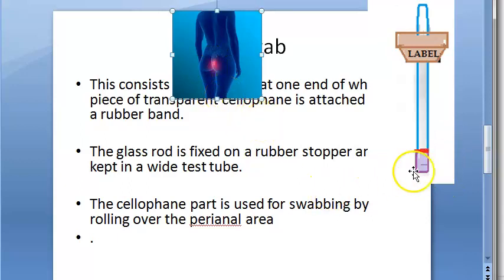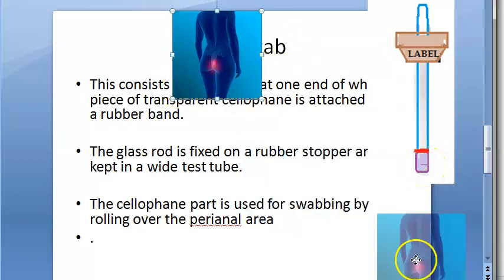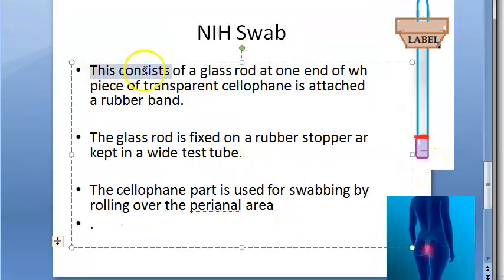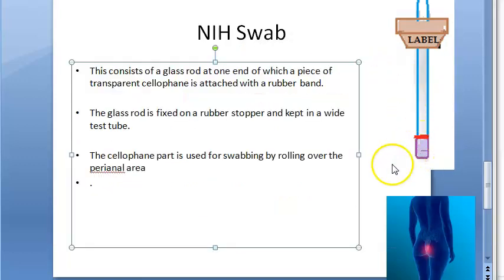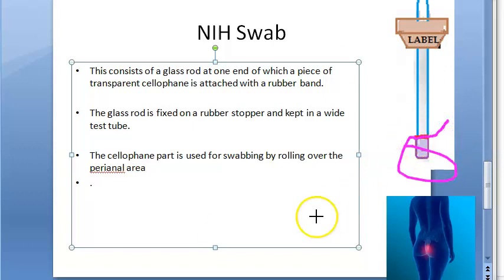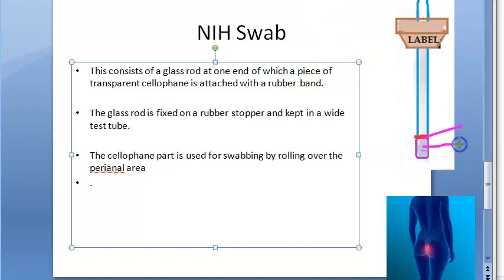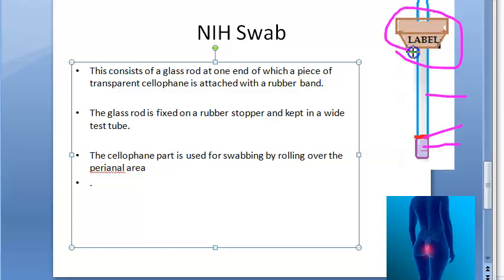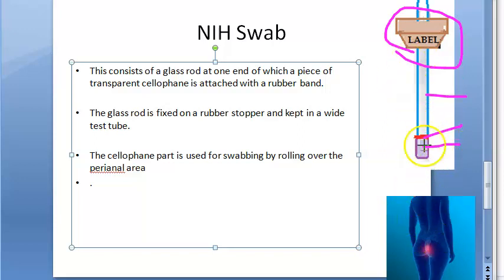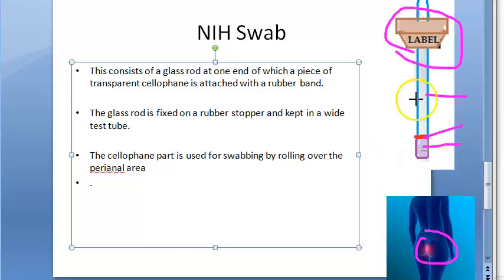It consists of a glass rod, one end of which has a piece of transparent cellophane attached with a rubber band. The red color part is the rubber band, and this is the cellophane. It is fixed to a rubber stopper so you can hold it, and it is kept in a test tube. When you want to take a perianal swab, you take this glass rod and roll the cellophane part over the perianal area.